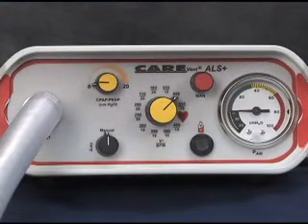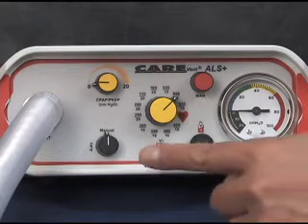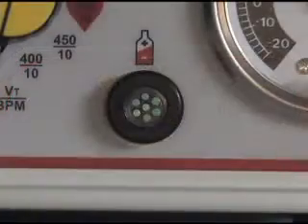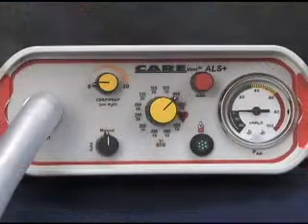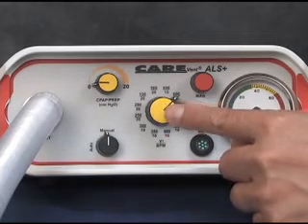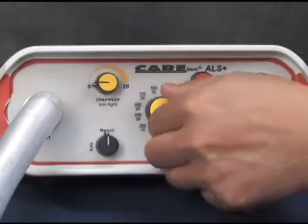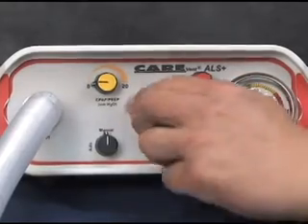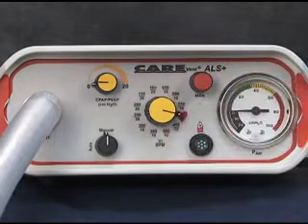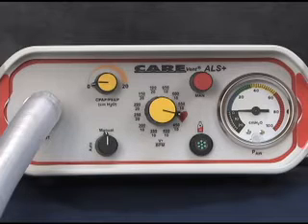The CareVent ALS Plus and ALS Plus CPAP ventilators are equipped with 3 controls. The manual auto control, when in the manual position, allows the gas supply to be turned on, placing the resuscitator in a ready state for any breathing emergency. The single rotary setting selector control for the simultaneous adjustment of frequency and tidal volume provides 12 settings of automatic ventilation, with each position being preset. The range extends from small children to large adults, and all settings are calibrated in line with the current resuscitation guidelines.